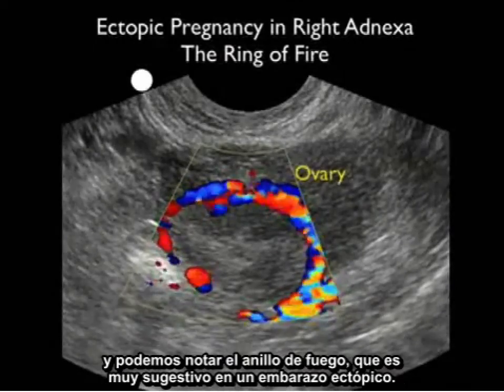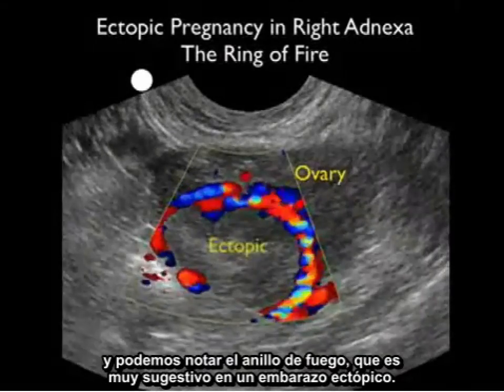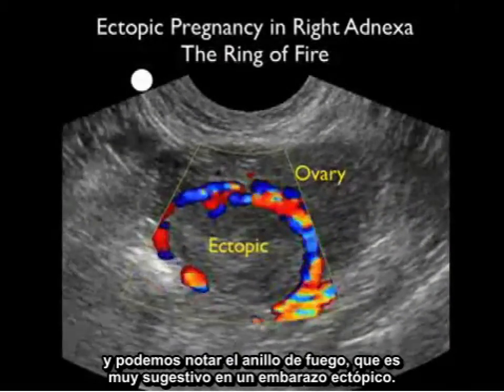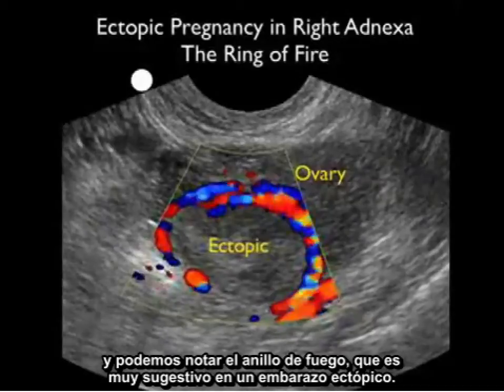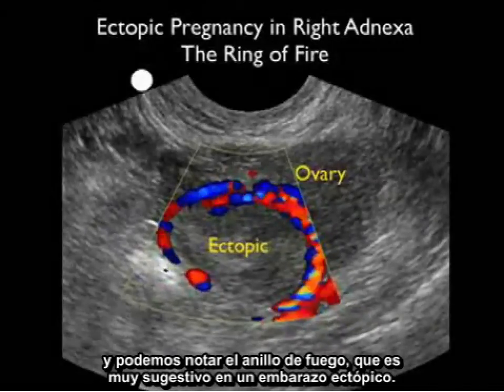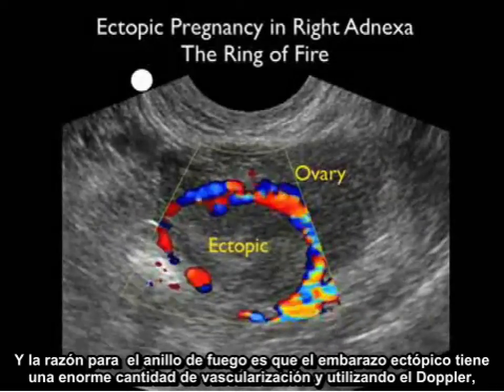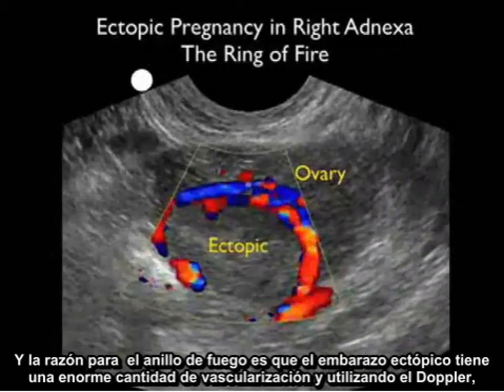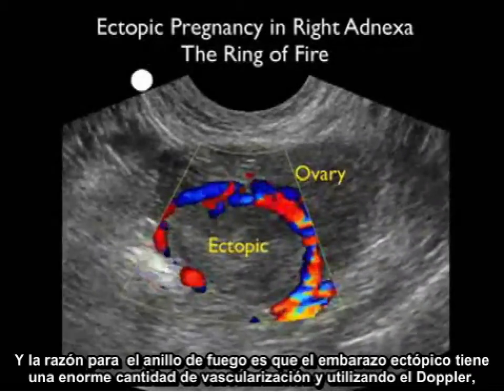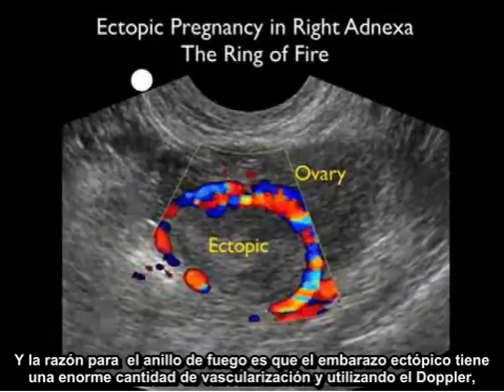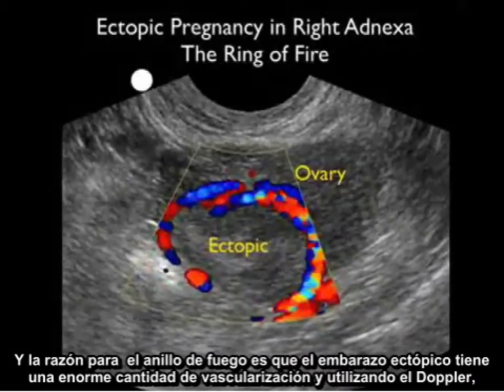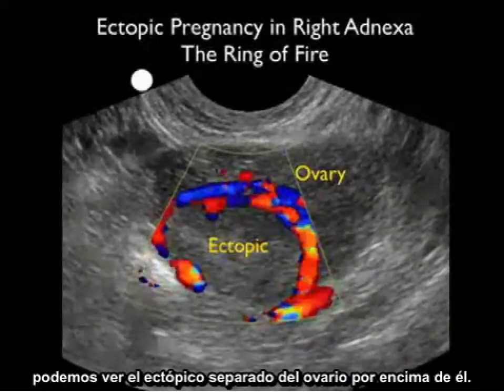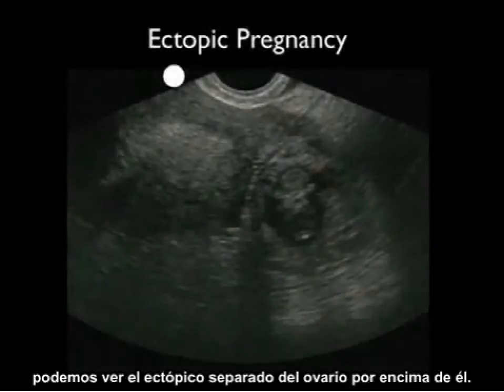we notice the presence of the ring of fire, very suggestive of an ectopic pregnancy. The reason for the ring of fire is that the ectopic pregnancy pulls a huge amount of vascularity towards it. And using the Doppler, we can see and separate the ectopic from the ovary above it.